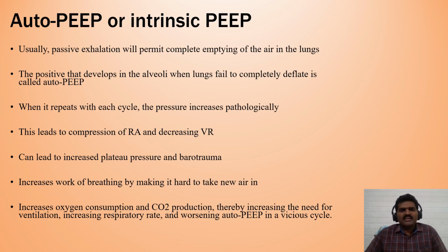There is something called auto-PEEP or intrinsic PEEP. Extrinsic PEEP is the positive end expiratory pressure that you apply through the ventilator. Intrinsic PEEP is the one which develops inside the lungs, especially when there is patient-ventilator asynchrony, and this leads to reduced hemodynamics.